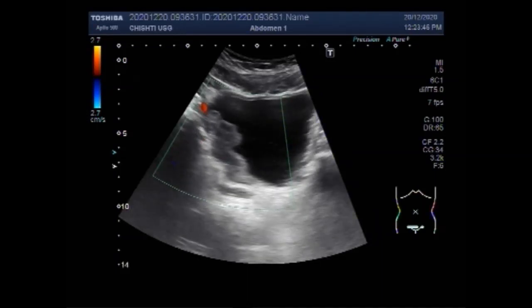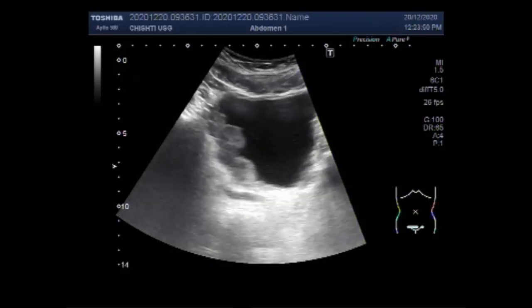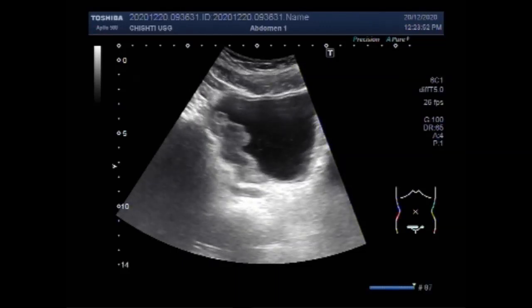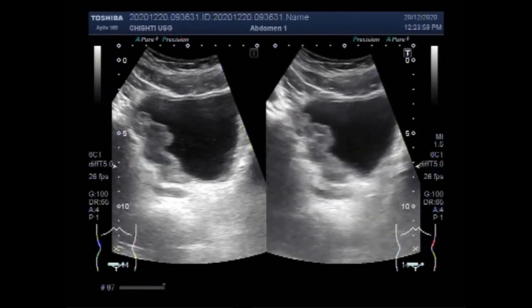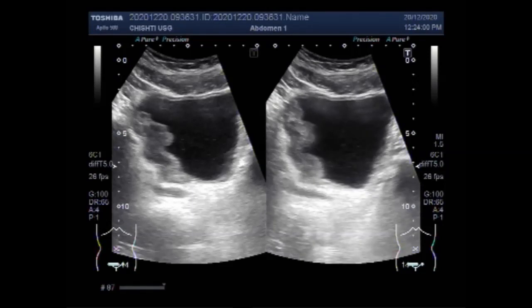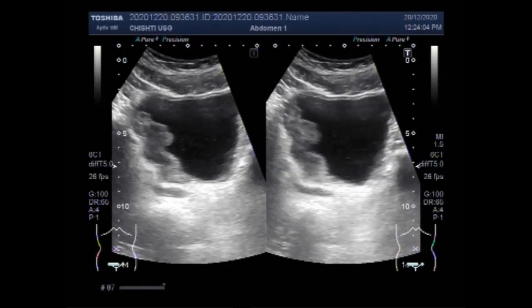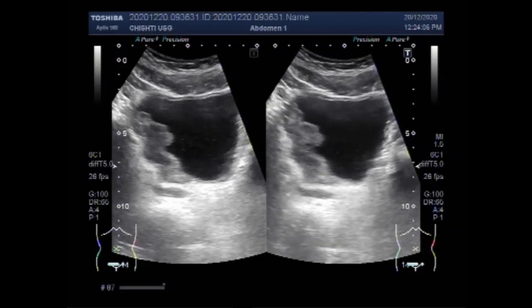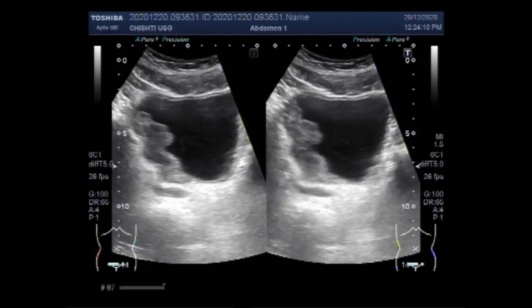One of the basic abdominal organs that are assessed during transabdominal ultrasound examination is the urinary bladder. The bladder must be filled with urine. This is a prerequisite for a reliable assessment, and at the same time, an acoustic window in examining adjacent structures and organs, for example, prostate gland and female genital organs.